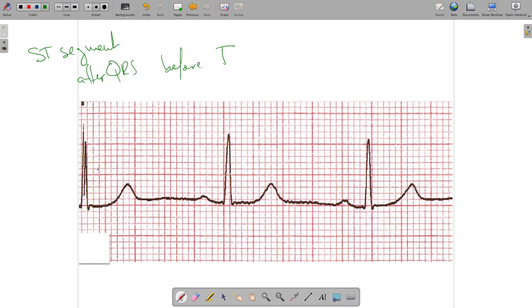All right, so let's take a look here. So this is a QRS complex. Here's a big, tall R wave, this little S wave that follows here. And right at the end of this S wave, there is this point in time where it returns to isoelectric. And right at the end of this isoelectric line, right before it starts to go up, right about here, this little section here is very isoelectric. It's on this isoelectric line. This is the ST segment. So this here, ST segment. This here, ST segment. Then we have the T wave that follows it.